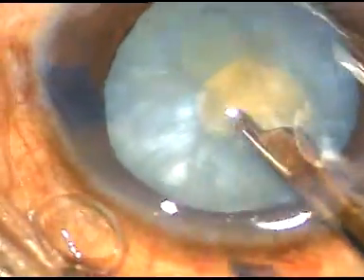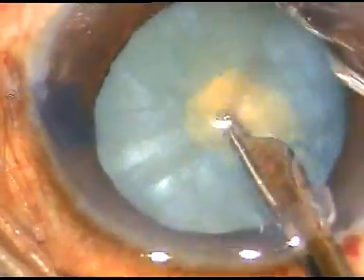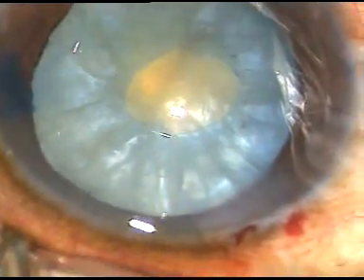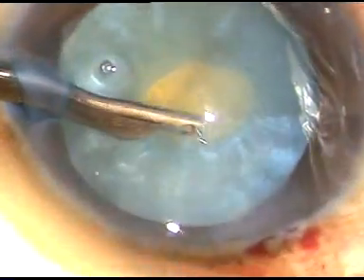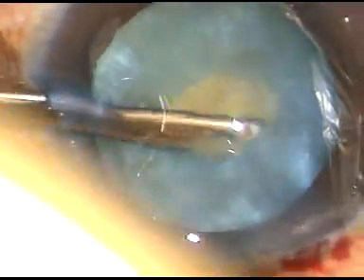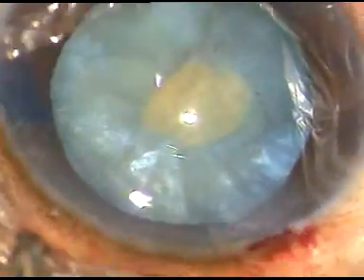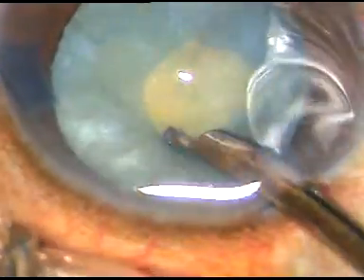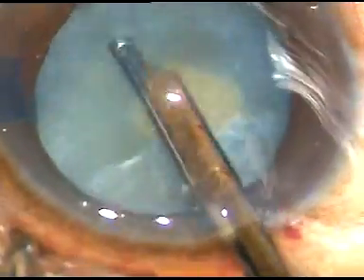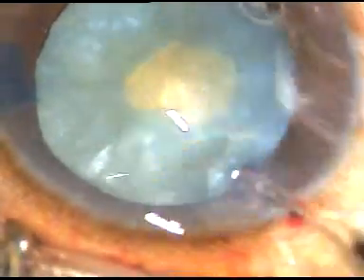Now, since this is a continuous curvilinear capsulorhexis, small rhexis, this rhexis can tolerate some force. It can tolerate some resistance. So we can aspirate some cortical matter through this small rhexis, and even if this rhexis margin is being pressed now and then, it doesn't tear.